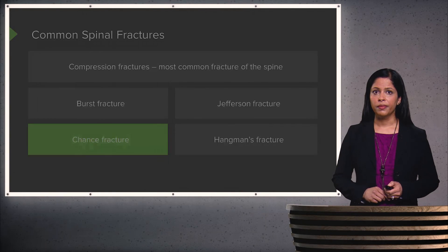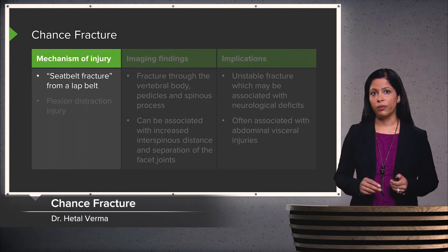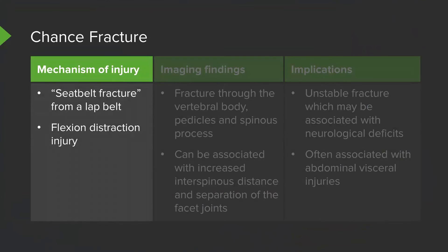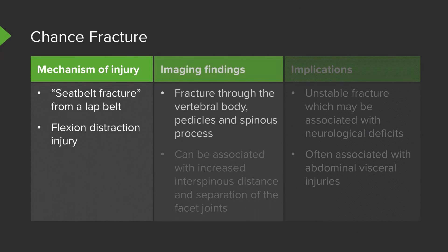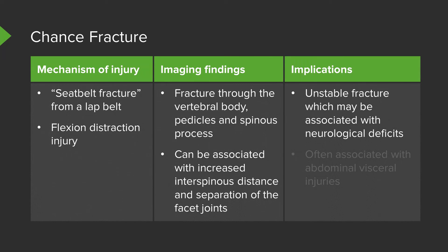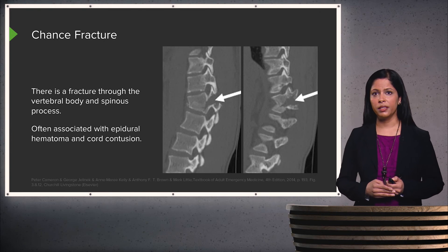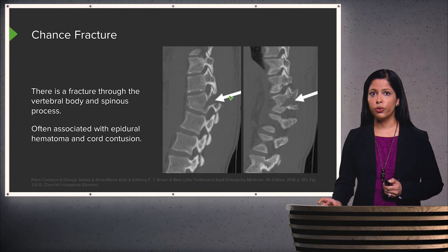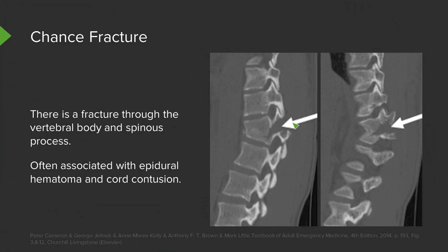A chance fracture, also called a seat belt fracture, is usually caused by a lap belt in a motor vehicle accident. This is a type of flexion-distraction injury with fracture through the vertebral body, the pedicles, and the spinous process. It can be associated with increased interspinous distance and separation of the facet joints, making it a very unstable fracture that can cause neurological deficits. It's also often associated with abdominal visceral injuries due to the lap belt, as well as epidural hematoma and possibly cord contusion. Two CT sagittal images demonstrate fracture through the vertebral body and spinous process, confirming the chance fracture.